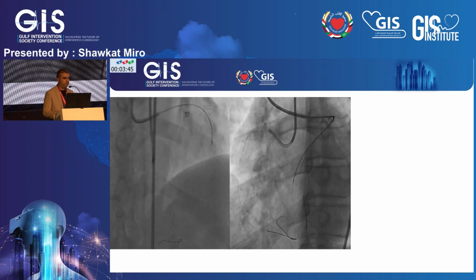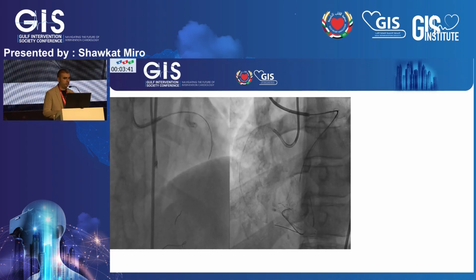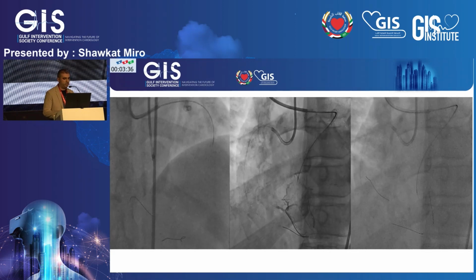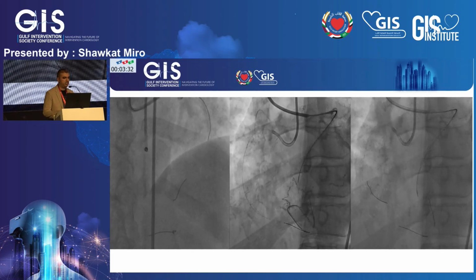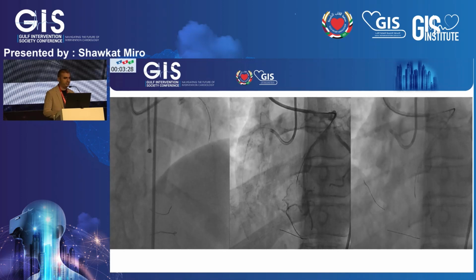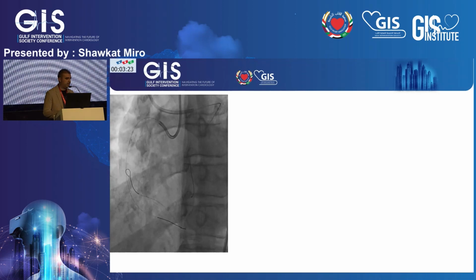But the problem I faced at that time, after we confirmed the position of the SUOH 03, was that I could not advance my microcatheter distally. But I did manipulation of the wire, and I was surprised that the SUOH 03 advanced a very long distance, and it almost reached the proximal cap.